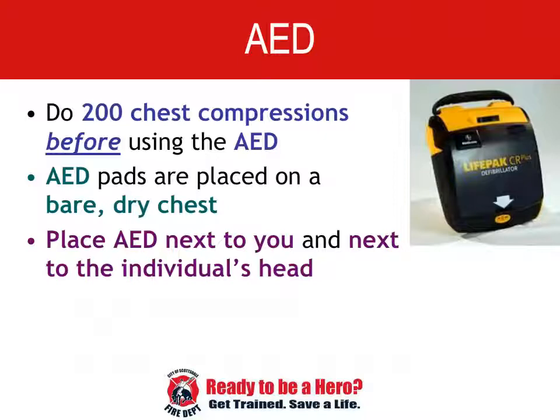After you place the pads on the chest, the AED will analyze the heart rhythm. If you are touching the person at this time, the machine will pick up your heart rate and will not recommend a shock. Ensure no one is touching the patient. The AED is looking for a specific rhythm. If it finds this shockable rhythm, it will tell you that a shock is advised and will begin charging.